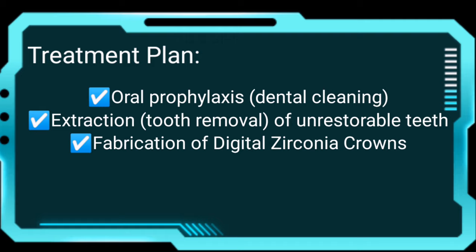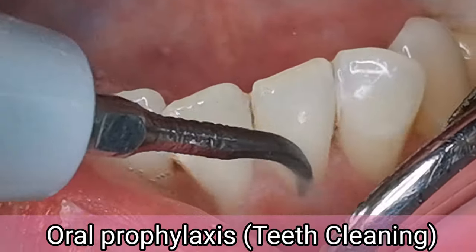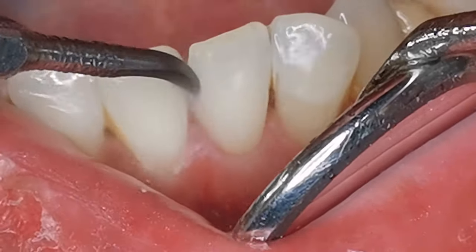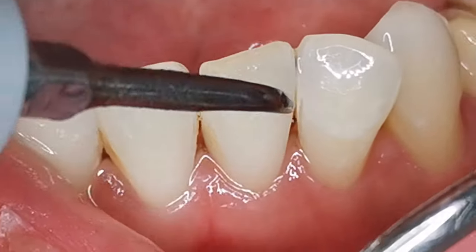Through online consultation, I was able to understand her dental concerns and goals, so I requested a dental x-ray to finalize the treatment. Our goal was to remove the tartar and plaque from the surfaces of the teeth, as well as those hidden in between and under the gums. It is essential to clean it to reveal the natural color of the teeth masked by discoloration caused by stains, and also to prevent tooth decay and gum disease.